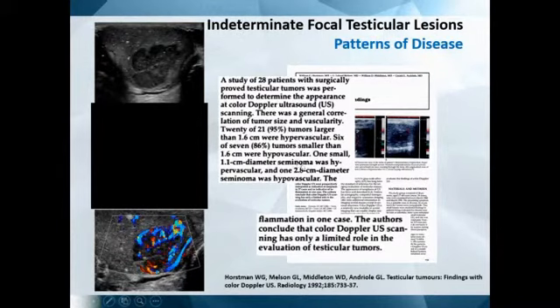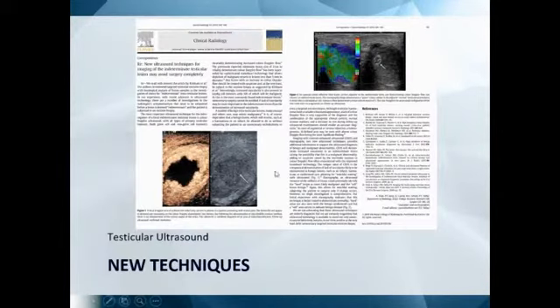This is incorrect now, because we know that we can see vascularity in tumours right down to 4 or 5 millimeters, but does it always indicate that it's malignant? So yes, we can use colour Doppler, and we can improve it with use of contrast. But we've got to make use of all the new techniques, and this is where we use multiparametric imaging to look at the testes.